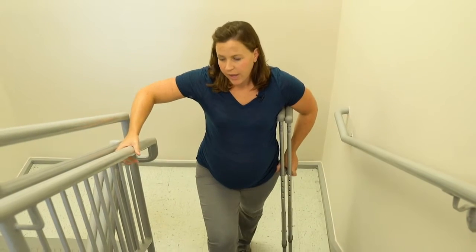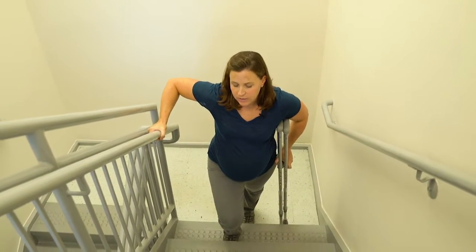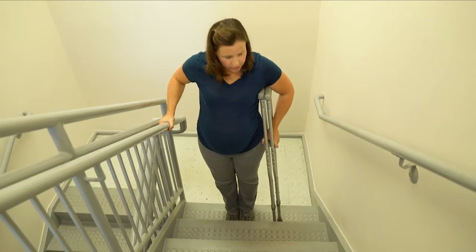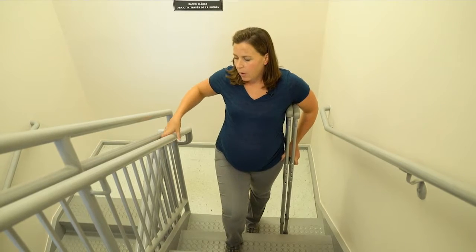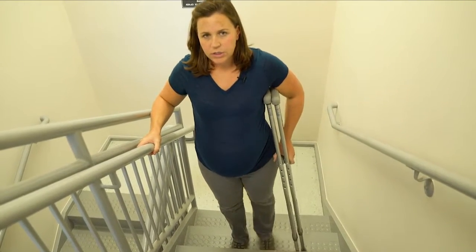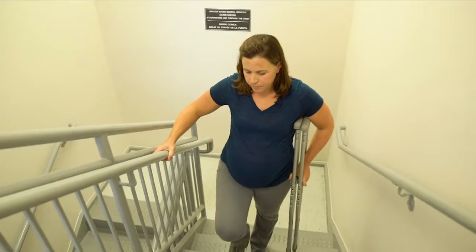Step up with your good leg and push through. You can use your hand on the railing to help steady yourself and bring your affected leg and crutches up with you. So up with the good, and then bring the crutch and affected leg up with you.